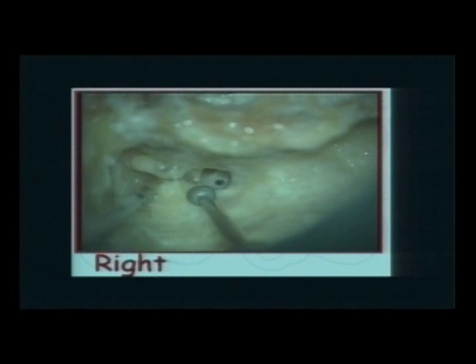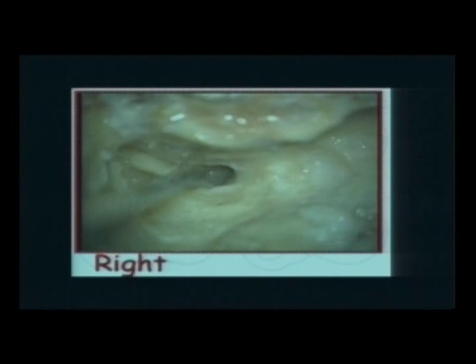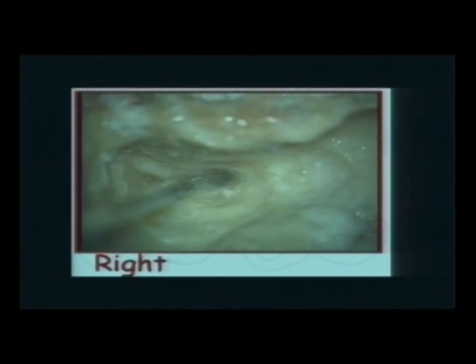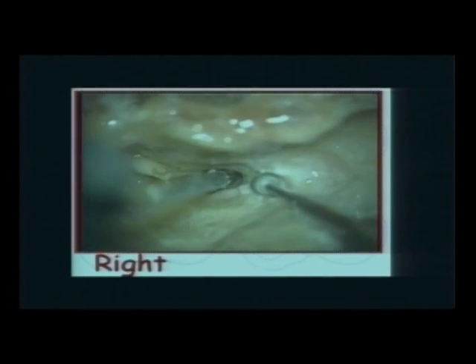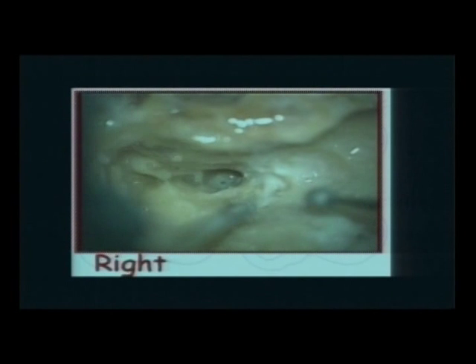I've done a cochleostomy in this patient, as you can see. But now the most important thing, I'm exposing the facial nerve. You can see the short process of the incus points to the facial nerve. There's the facial nerve. I've exposed the facial nerve in this part. And I'm removing bone on the lateral canal, very gently without opening the lumen of the lateral semicircular canal, because if you open it, you've destroyed it. So you just remove bone until you see a line which is inside the bone. It's like a blue line. And then start removing bone on the facial nerve.